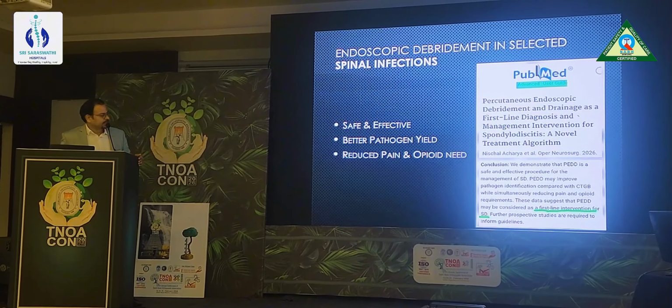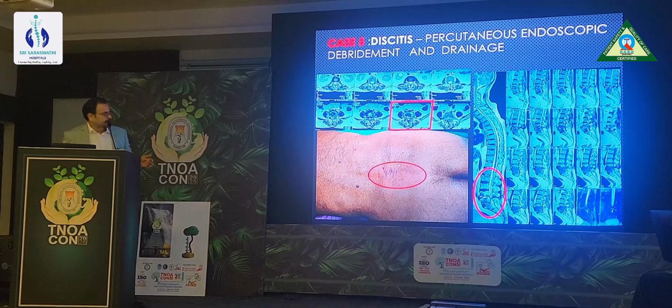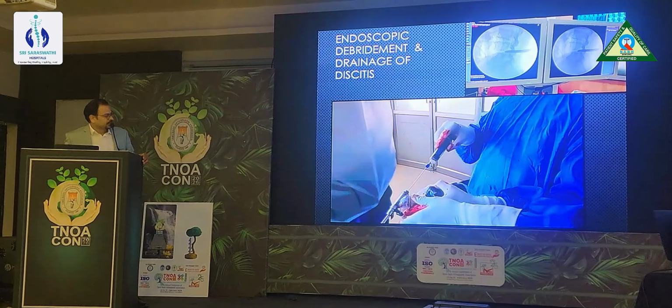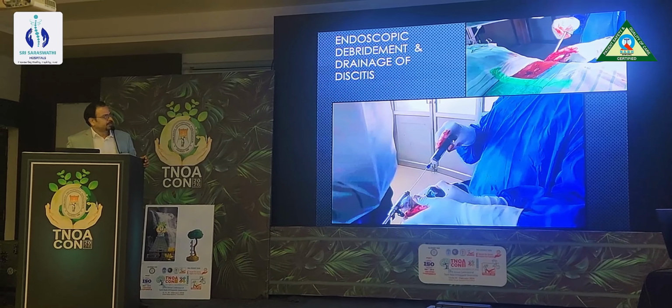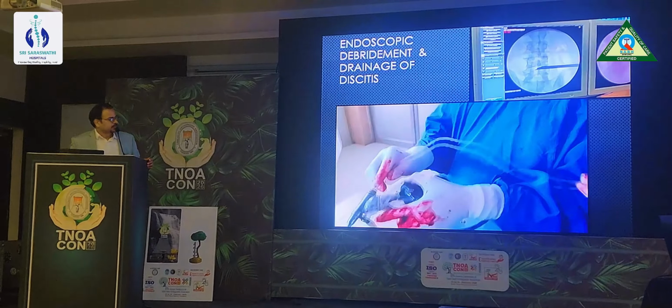Similarly, discitis can be addressed. It is a safer method. This is a previously operated patient with infected disc material. We remove the disc and we debride it, and we send for culture sensitivity.